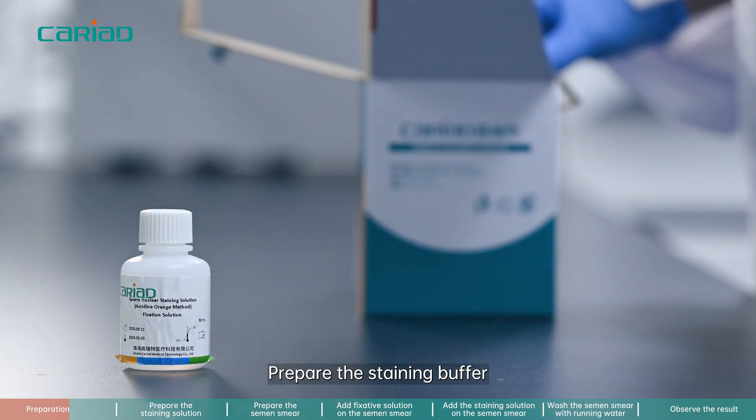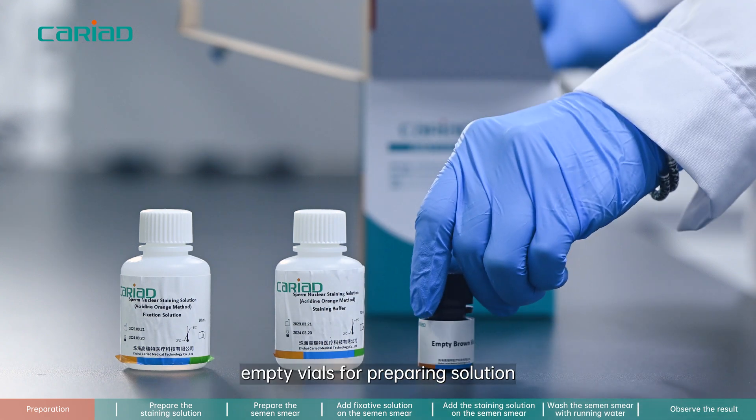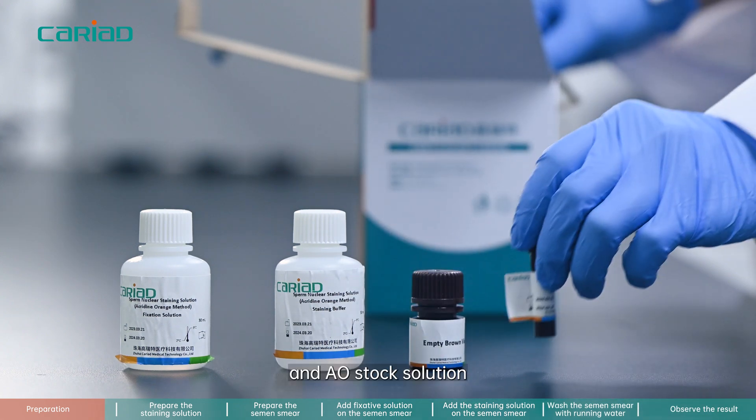Prepare the staining buffer, fixative solution, empty vials for preparing solution, and AO stock solution.